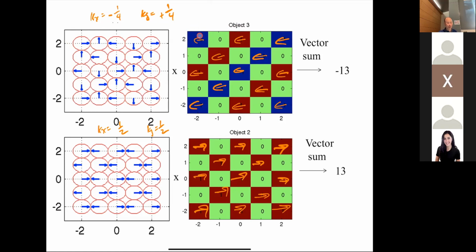That's sort of weird. Obviously, this is not going to have any negative protons in it. But later on, it turns out that if spins are flowing, we can actually sensitize the MR to the direction of the flow. So this might be a voxel that has blood flowing one way, and this would be a voxel that has blood flowing the other way. And that actually can flip the phase of the spins.